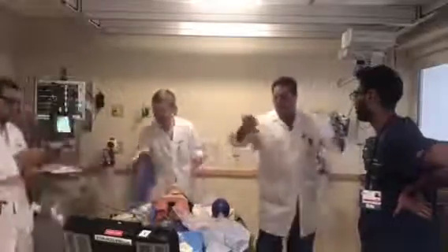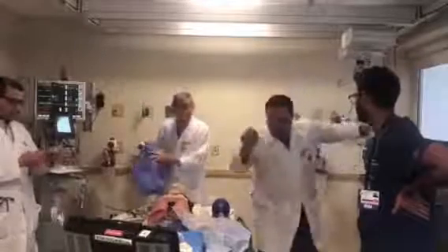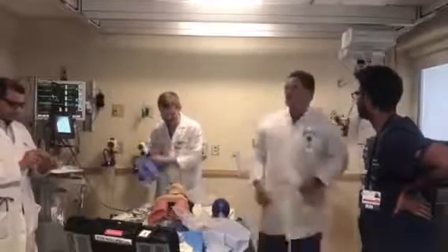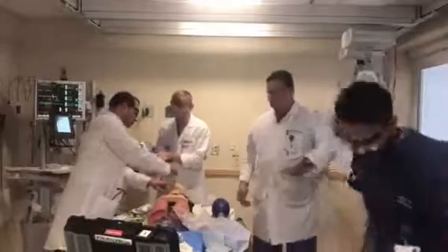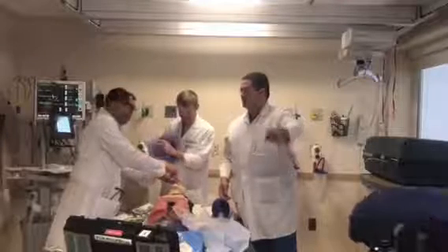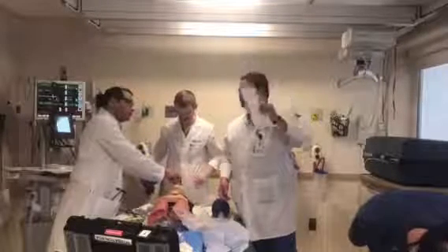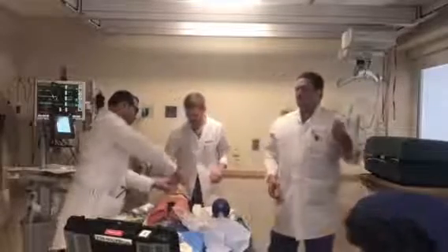When they go and the car is flipped upside down and the patient's doing like this and not breathing, and they go like this. Done. It's so easy. So all this is available on the floor? No, they're available in difficult airway carts. So there's 4 or 5 difficult airway carts in the hospital. One in the ICU, one in the endo, one in the OB, and one in the OR, and I think one in the ER.